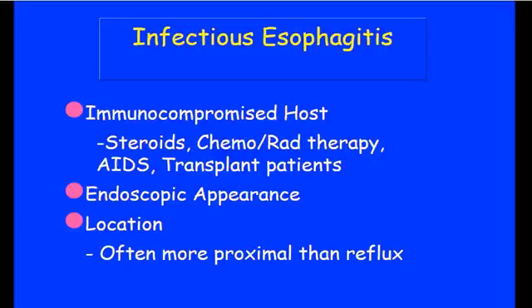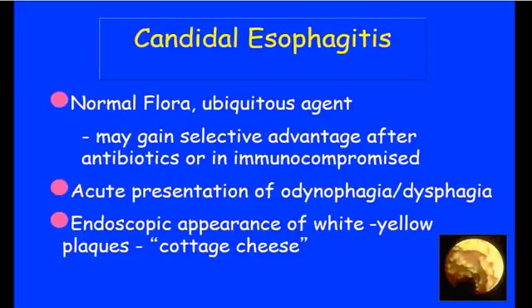Again, location and endoscopic appearance can be a help if you get that information with your biopsy. And it's often more proximal than reflux, but it doesn't have to be. So Candida is pretty ubiquitous. I think we've all seen plenty of Candidal esophagitis cases.